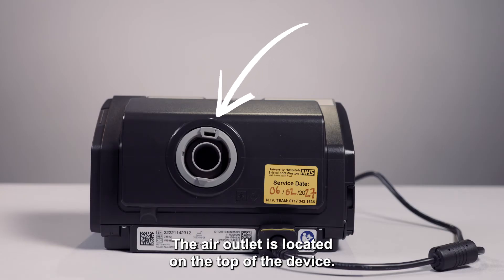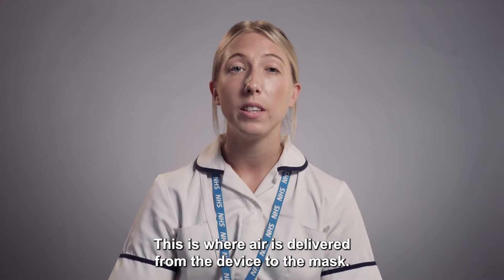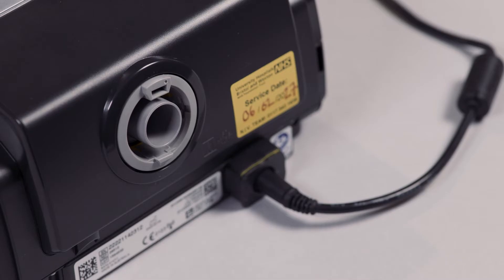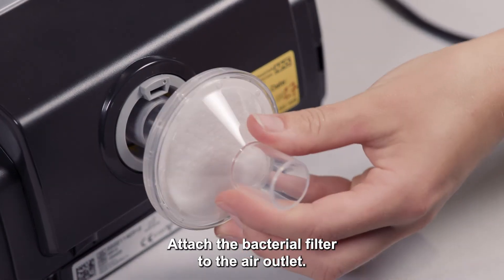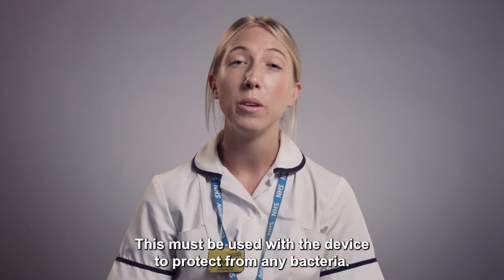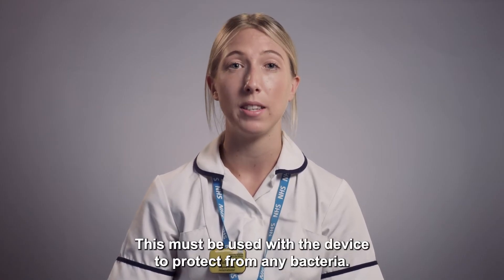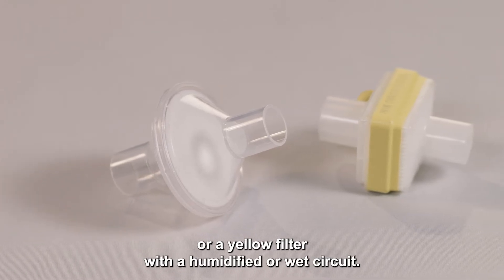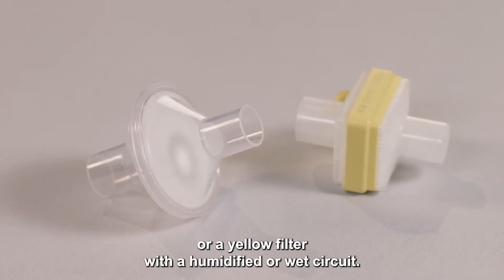The air outlet is located on the top of the device. This is where air is delivered from the device to the mask. Attach the bacterial filter to the air outlet — it will only attach one way, so you can't get this wrong. This must be used with the device to protect from any bacteria. You will use a white filter for a dry circuit, or a yellow filter with a humidified or wet circuit.